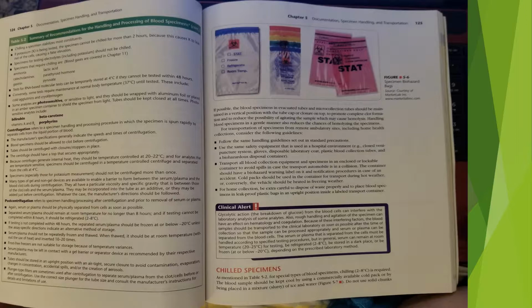Cold packs should be used in the container for transport during hot weather, or conversely, the vehicle should be heated in freezing weather. For home collection, be extra careful to dispose of waste properly and to place blood specimens in leak-proof plastic bags in an upright position inside a labeled transport container.